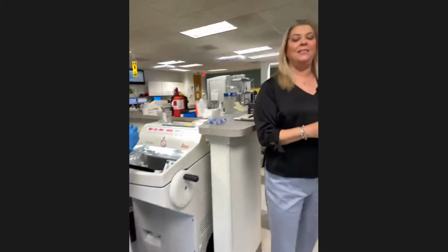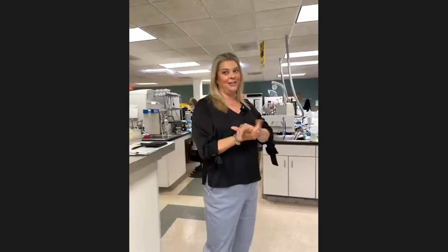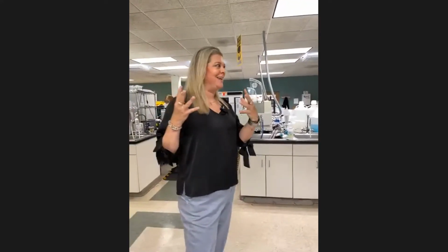Awesome. Thank you, Beth. Appreciate it. All right, so that's the magic for immunofluorescence. So tissue, a machine called a cryostat this time, and they put it on the slides, and then we'll make a different slide for every antibody that we're testing for. So routinely, we'll do 9 antibodies here, and then we can add on special antibodies depending on what kind of history the patient might present with. If we suspect any certain thing, we will go ahead and do some special antibodies for those as well. But antibodies on there, and this one is light sensitive, so we definitely keep it covered. Like she said, we'll wait on that magic fluorescence to happen. So, all right, so that's it for immunofluorescence.